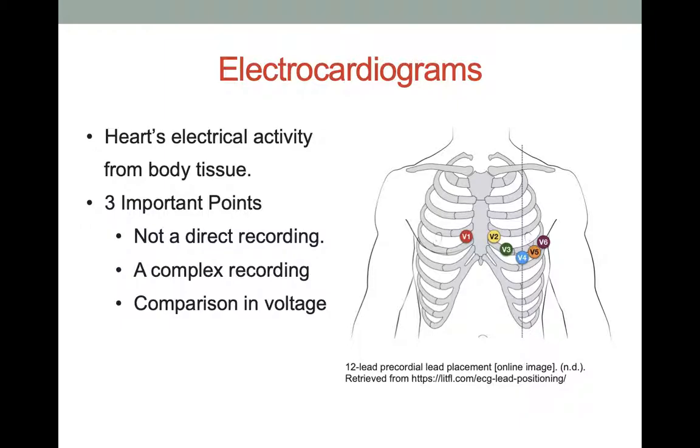Number one, it is not a direct recording of the actual electroactivity happening in the heart. We're taking the electrical activity that's present in the bodily fluids from the cardiac impulses that reach the body surface. Okay, so not a direct recording.